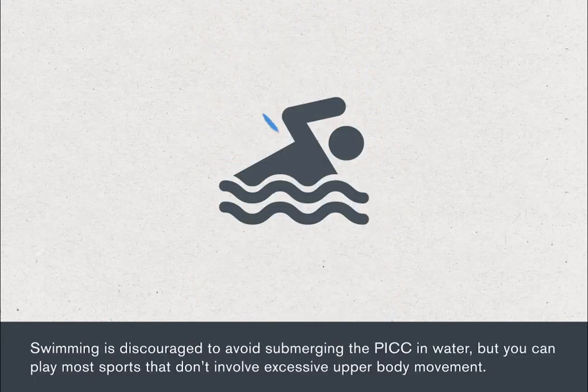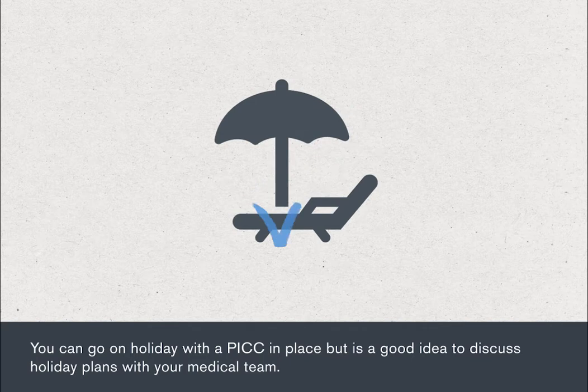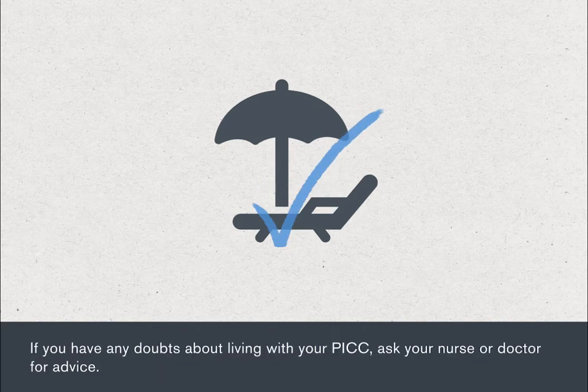Swimming is discouraged to avoid submerging the PICC in water, but you can play most sports that don't involve excessive upper body movement. You can go on holiday with a PICC in place, but it's a good idea to discuss holiday plans with your medical team. If you have any doubts about living with your PICC, just ask your nurse or doctor for advice.